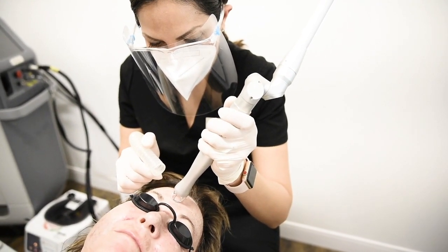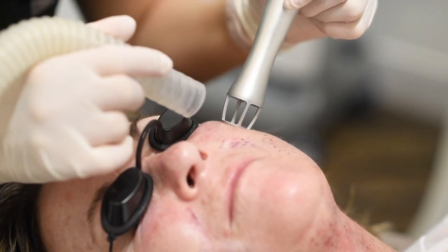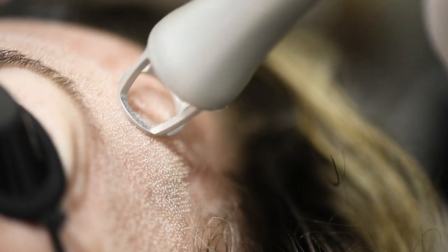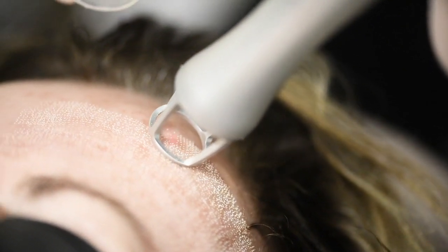So you come in already pre-numbed up. You're going to be asked to wash your face and wash all that off — it feels really weird because you're numb. You'll lay down in the chair. There's going to be a little vacuum you'll hear, because it's going to vacuum all the dead cells that can float in the air, which we don't want. Then you'll hear a little buzzing as the nurse practitioner uses the machine to put little layers of laser beams into the skin, creating a matrix that causes controlled injury and allows the surrounding healthy skin to aid recovery.